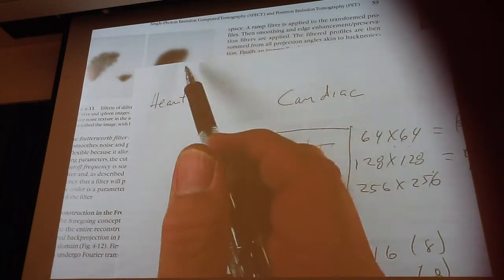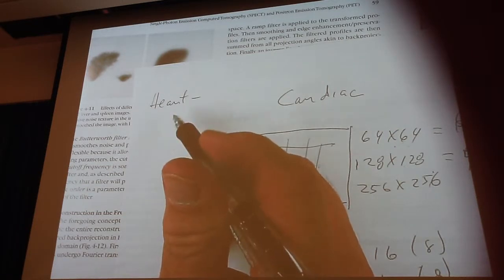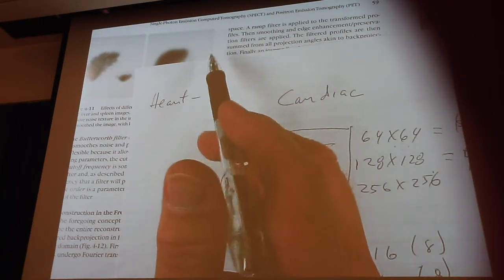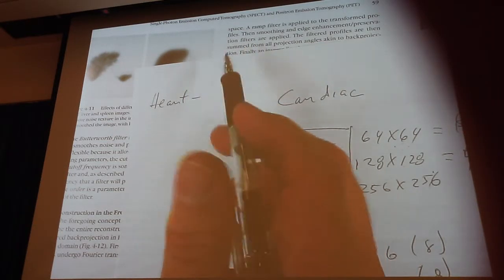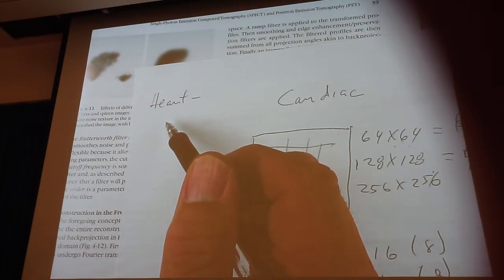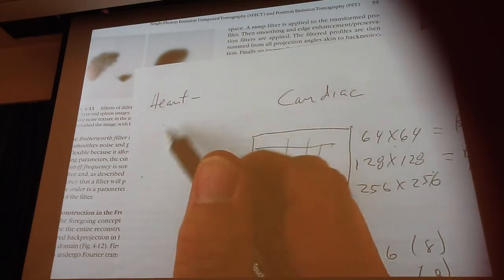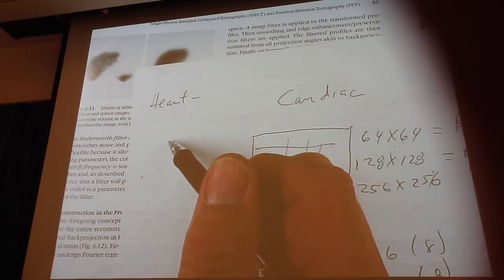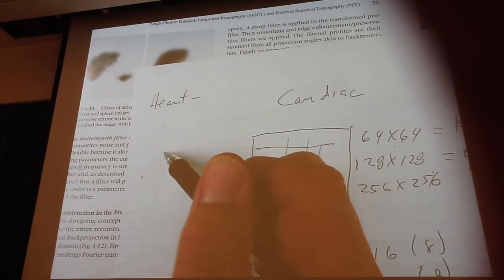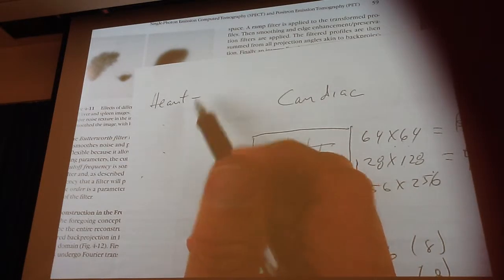Okay, and that's another thing you guys got to be real careful of, because when you look at those protocols, you can do them either way. You can do the stress first and then do the rest. Some people do that because if the stress is normal, there's no need to do the rest. If the patient came in because they were having chest pain, well, obviously you're not going to put that person on a treadmill, so you may do the rest first and then do the stress. Right? Would it make a difference which way you process them? Yeah. If you do the stress first and then do the rest, the computer's going to handle both of those images differently.